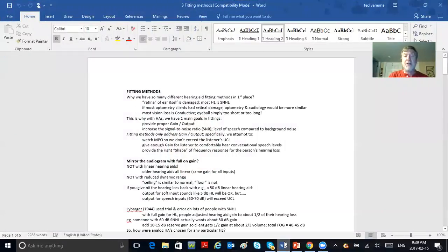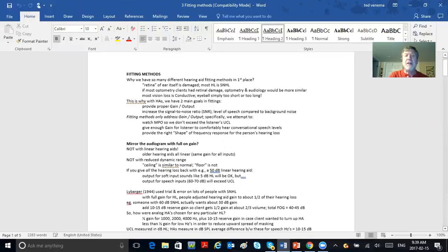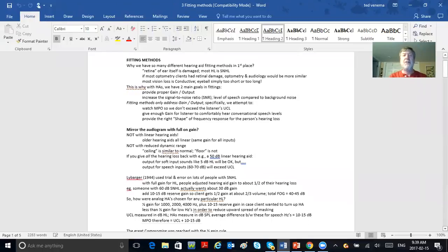So let's look at our notes here. I'm sharing screen here. Let's take a peek. Fitting methods. Why do we have so darn many of them in the first place? The retina of the ear itself is damaged. Most hearing loss is sensory neural. If most optometry clients had retinal damage, optometry and audiology would be more similar. Most vision loss is conductive. The eyeball is simply too short or too long.